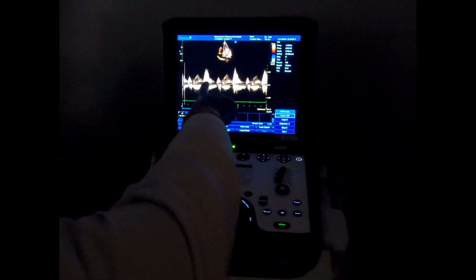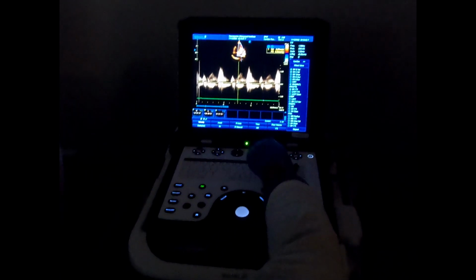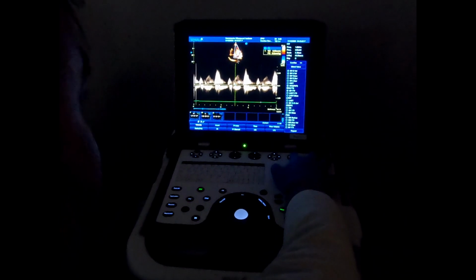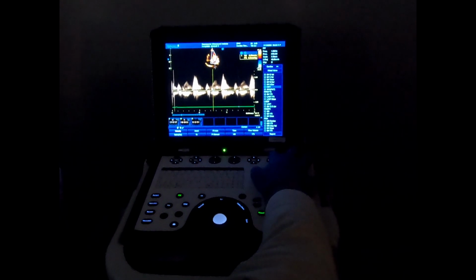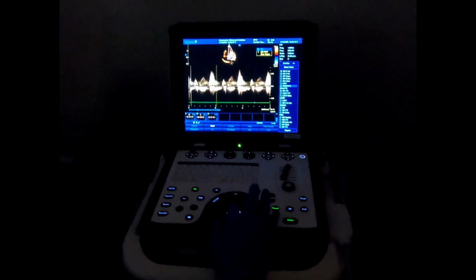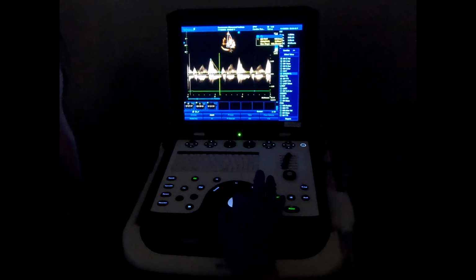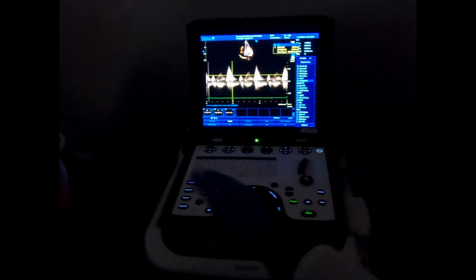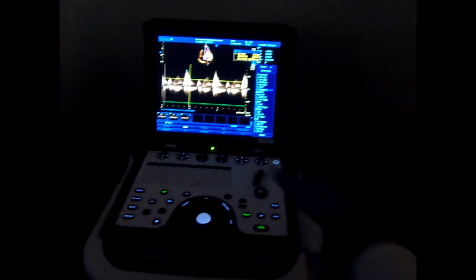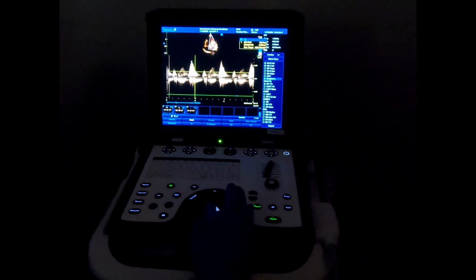There's one related to that particular question, if you are measuring. Let me just show you how you can measure the pressure half time. Tracing is easy, but let me give you an example: now you have a flow here, you don't follow like this. That's not good. You need to follow the initial slope. The flow added during diastasis is not reliable. You need to follow the initial slope. So this is your pressure half time.